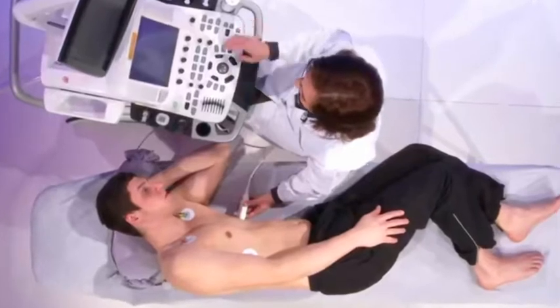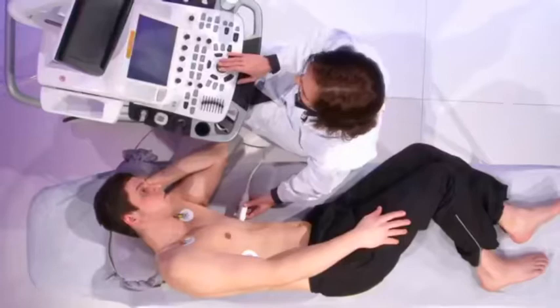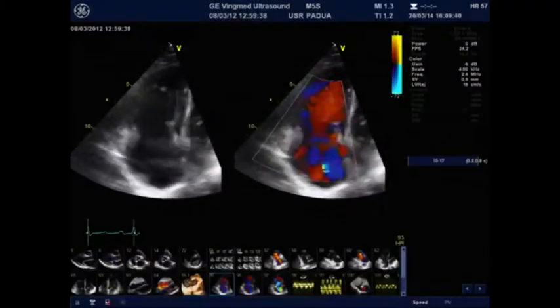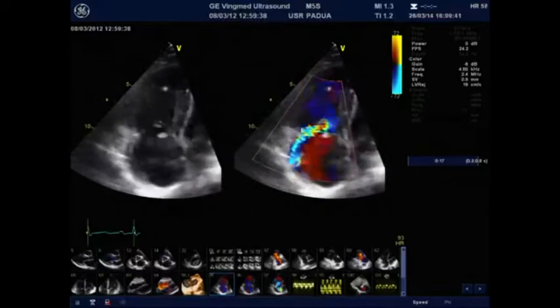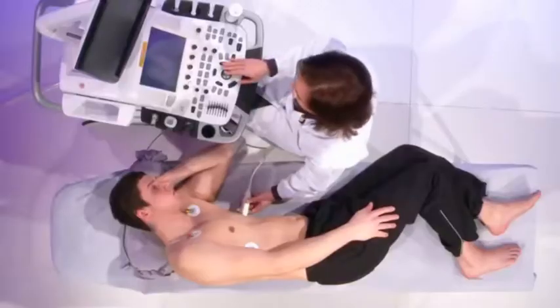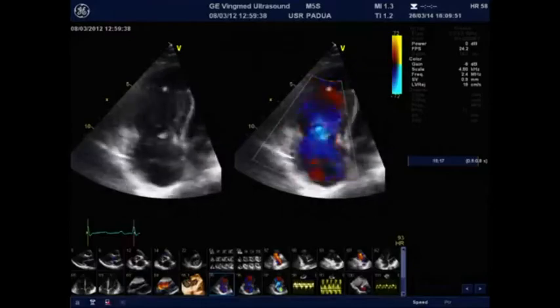In this case, in organic tricuspid regurgitations, since there is a swirling jet across the tricuspid valve that goes through the lateral wall of the right atrium, it is very likely that this jet can be underestimated.